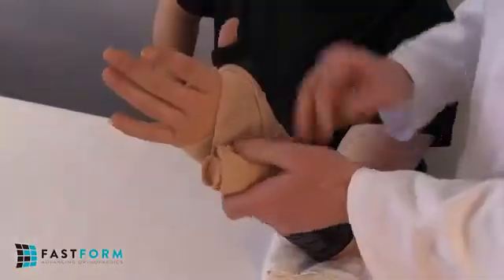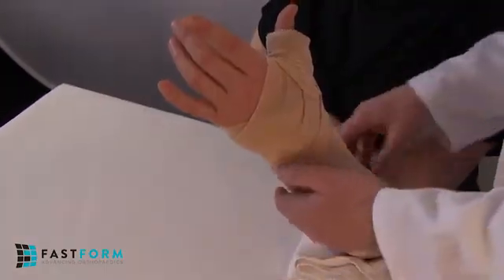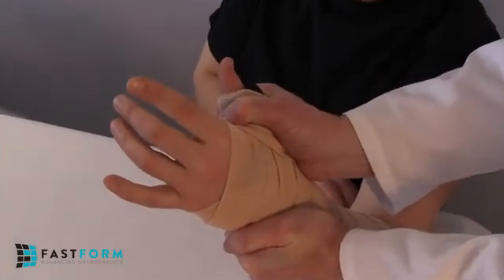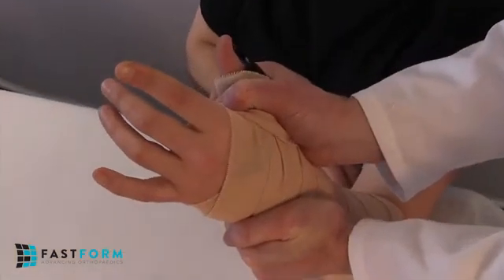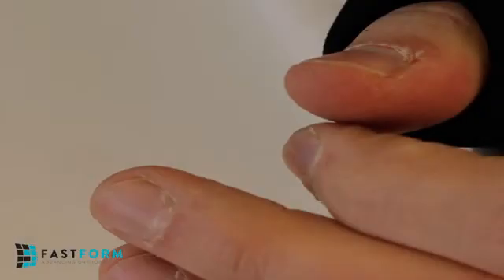Then, wrap an elastic bandage firmly, but not tightly, around the thumb and wrist, and continue from distal to proximal up the forearm. If desired, the elastic bandage can be dampened to accelerate cooling and setting of the Polytrex polymer. Next, begin molding the spica, thumb hole bridge, and palmar area with an arm wrestling grip to establish a comfortable fit, while simultaneously compressing the dorsal side with the opposite hand. Where appropriate, verify that the tip of the thumb and index finger can easily form a pinching grip for greater patient dexterity.